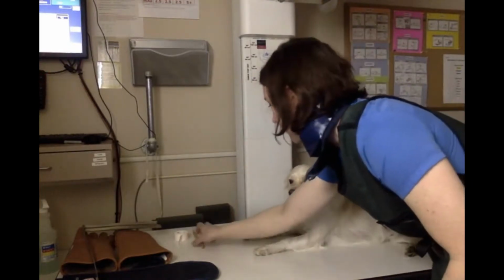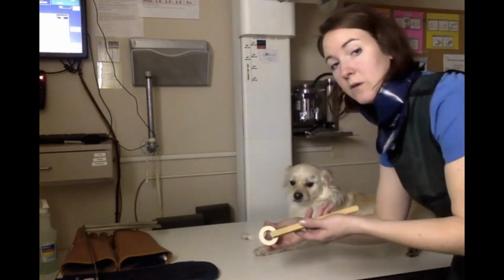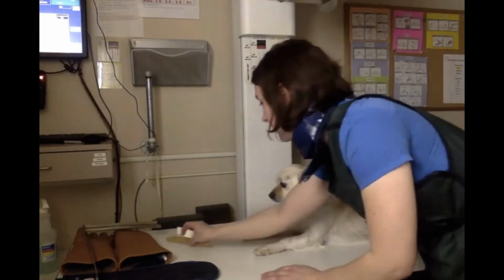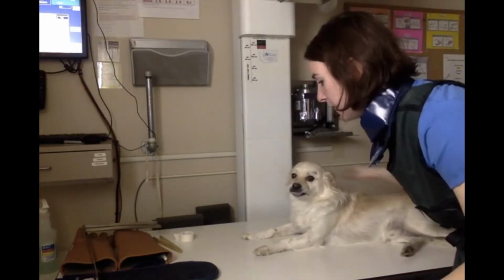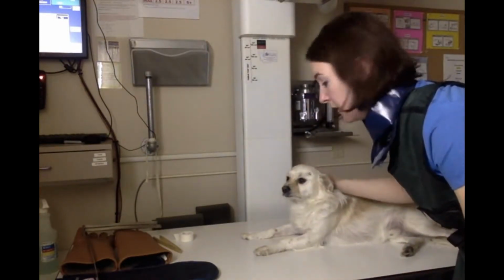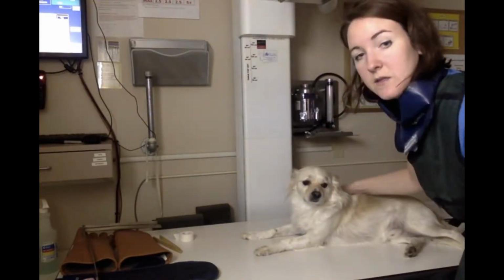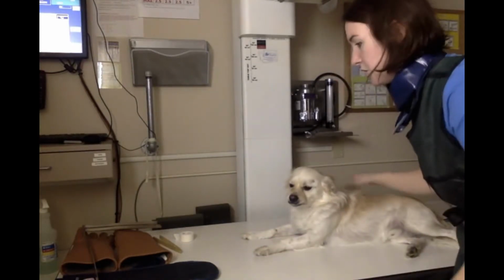So we have some tongs here we can use to pull their extremities out of the way and keep our hands further away. We also have some tape that we can use. We can also utilize some foam pads or a trough, and we're always going to wear our gloves. And Mr. Zico here doesn't need to go in a V-trough because we're going to be taking a picture of his extremity, so he's actually in a pretty good position here.